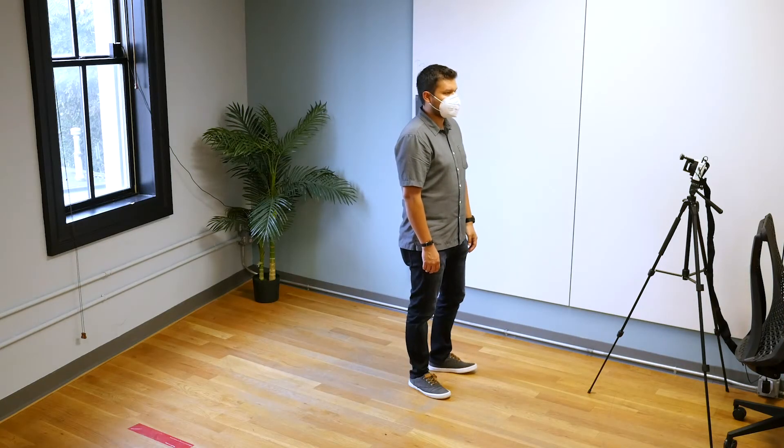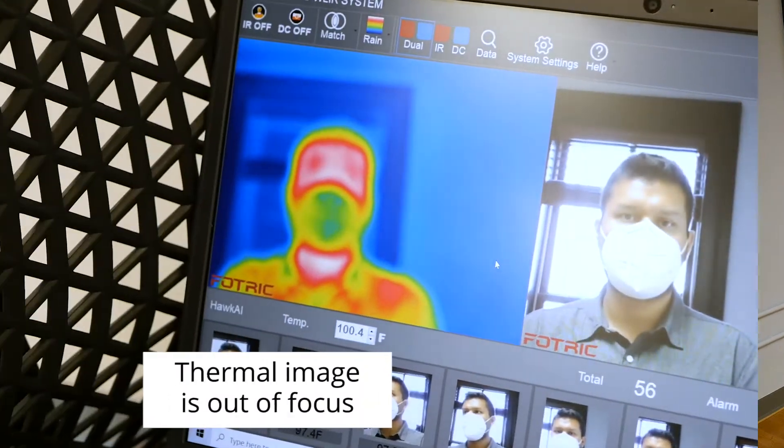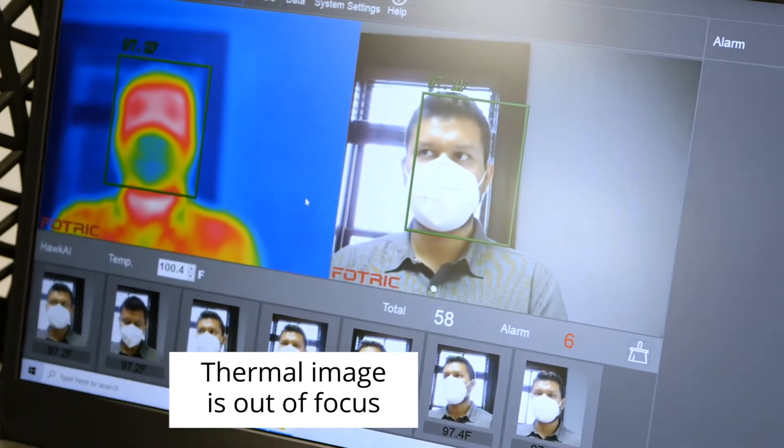The next issue is unique to the 226B. The camera is too low, so it's pointed upwards at the subject. It's also out of focus. Both of these issues will cause incorrect readings.